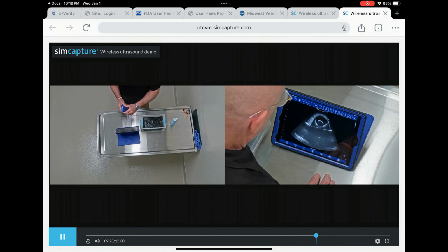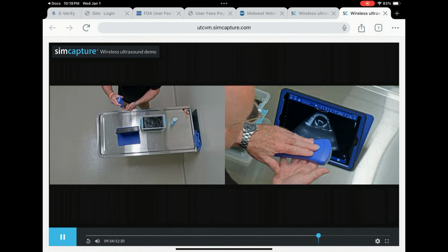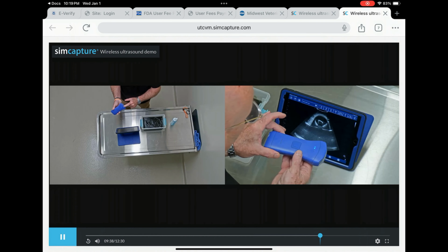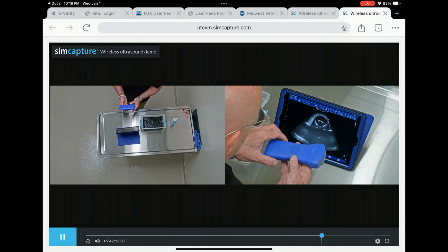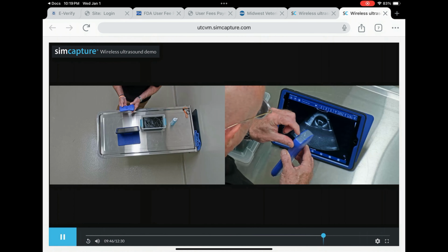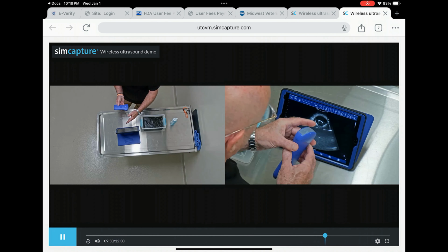Yes, there is crystal technology in the transducers, but we do have an edge around the transducer so that anything that is not a direct 90-degree hit on the crystals will end up on the plastic edge. So durability, affordability, portability, and image quality are the 4 cornerstones on which we build this device and the software.